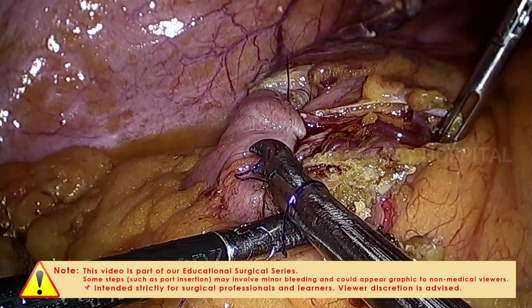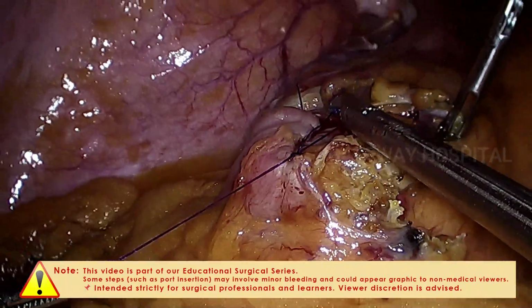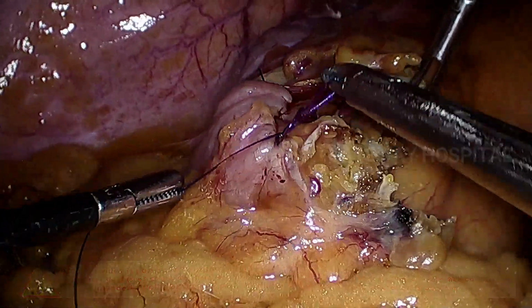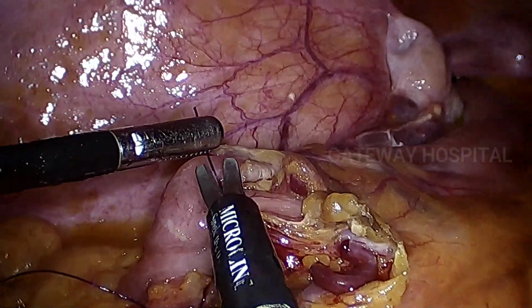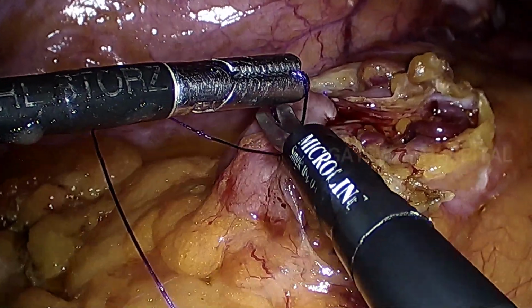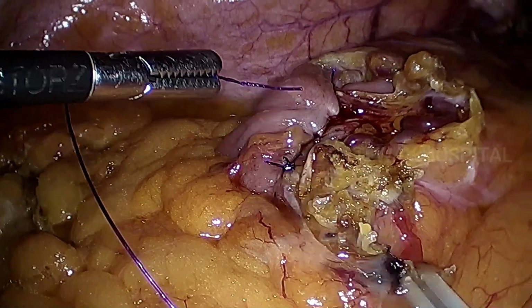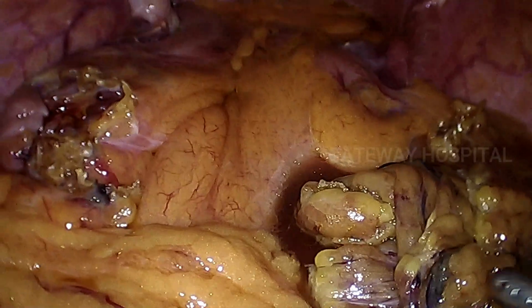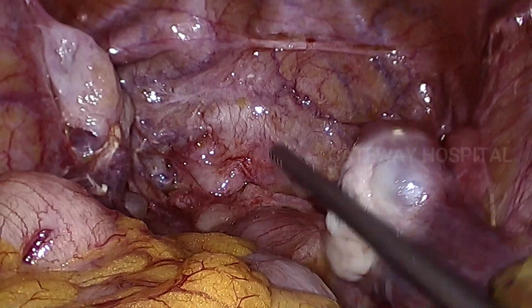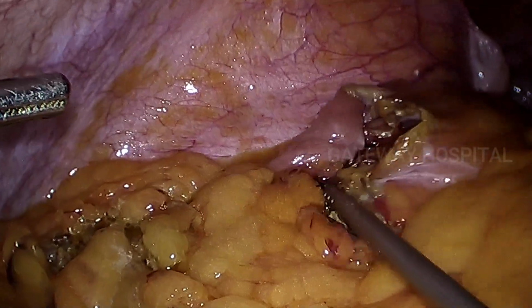Gastrointestinal stromal tumor, otherwise called GIST, arising from the omentum is very rare. Only a few cases have been reported in the literature, and this is one of the cases which we came across, and the same was removed by laparoscopic approach. You can see because of the proper usage of energy source, there is absolutely no bleeding, and this patient incidentally had a right ovarian cyst.